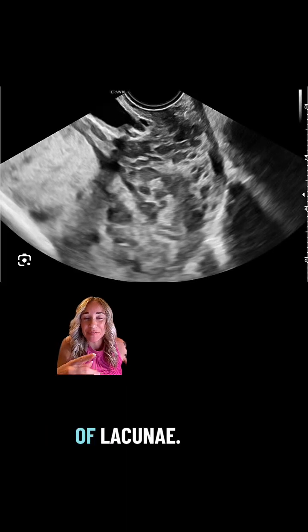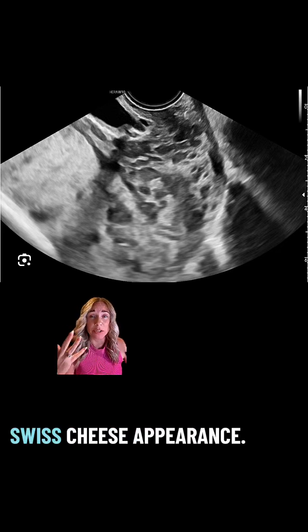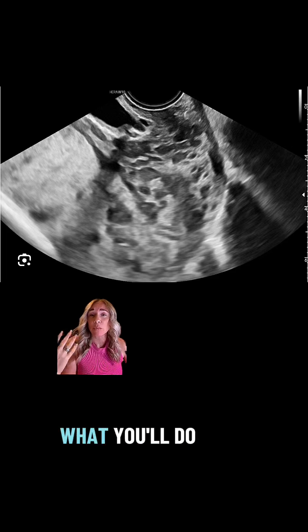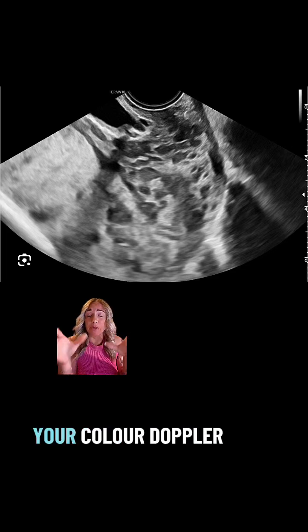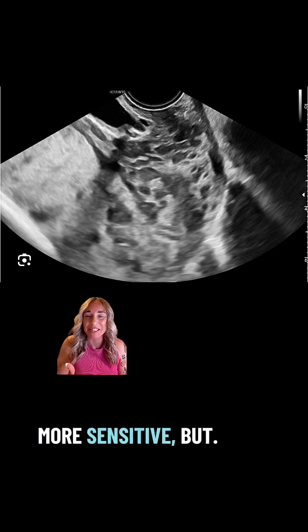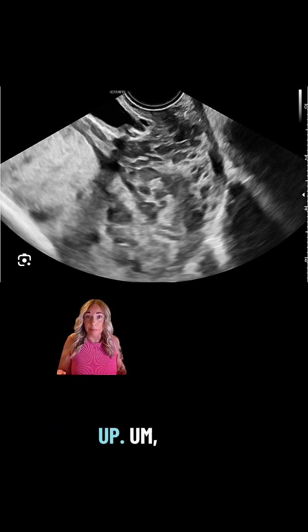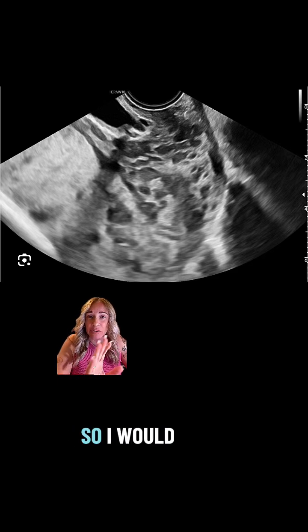Here's another image of lacunae, and as we say in sonography terms, this is a Swiss cheese appearance. And once again, what you'll do is throw your color Doppler or power Doppler on. We know power Doppler is more sensitive, but you can use either. If you use color, it'll still light up because that's one of the signs of an accreta. And yeah, I would also show that as well.